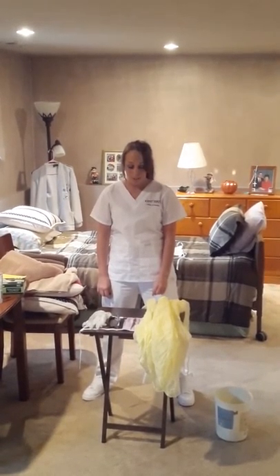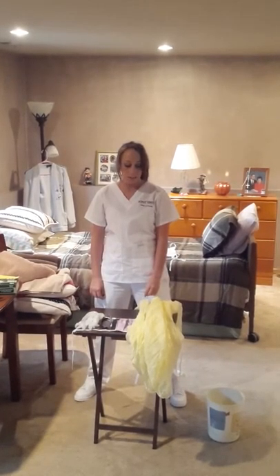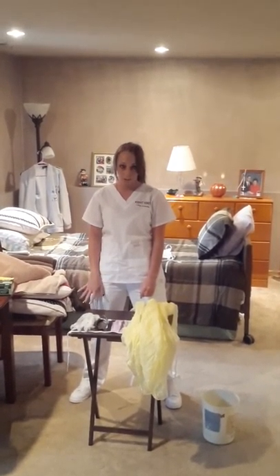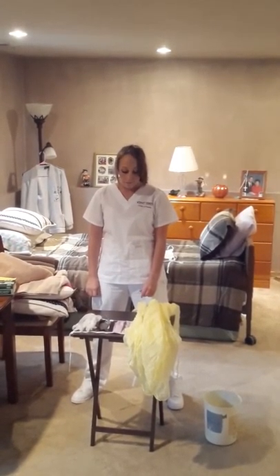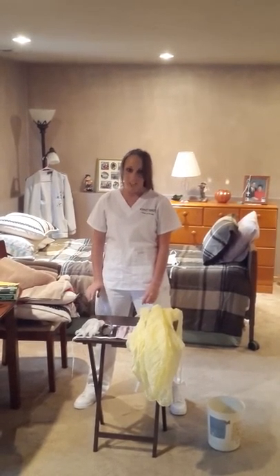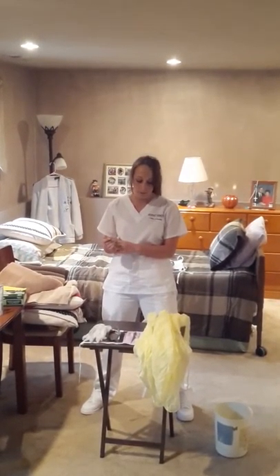My name is Emily Mays and I'm going to be showing you how to put on personal protective gear. Assuming your patient is in isolation, this is the correct order you would put it on, and then I'll show the correct order of taking it off. I will put the protective wear on either at the door or in the ante room. I will make sure my hands are washed prior to putting on my protective wear.